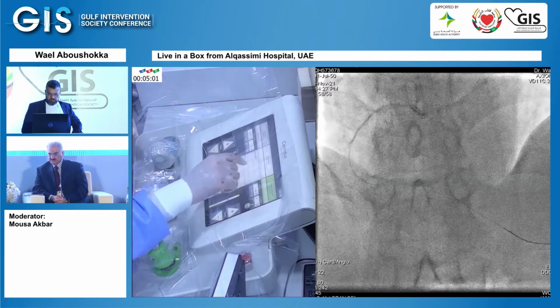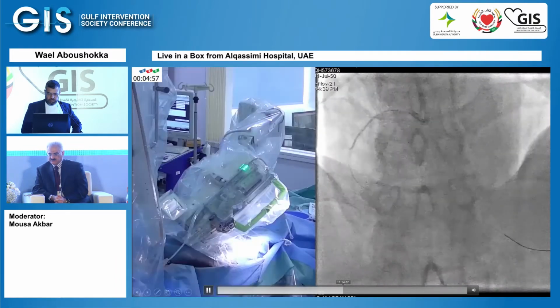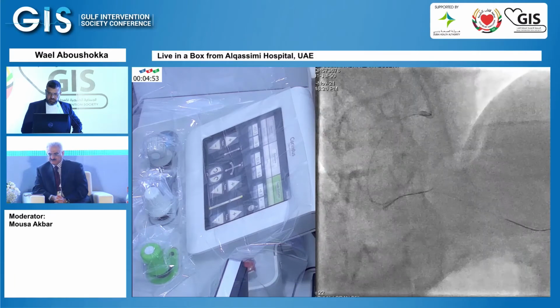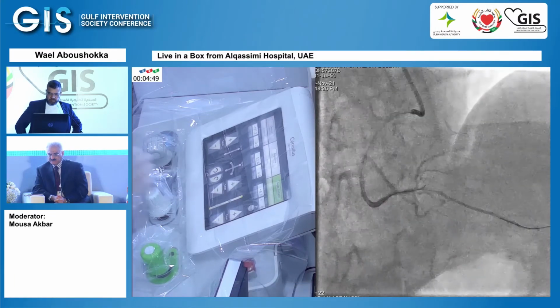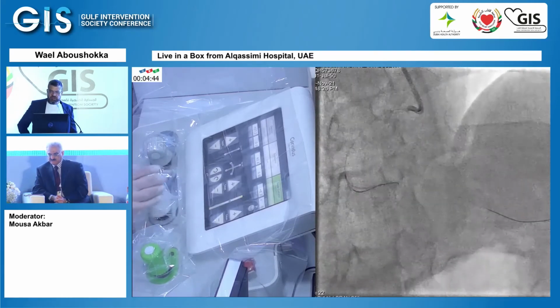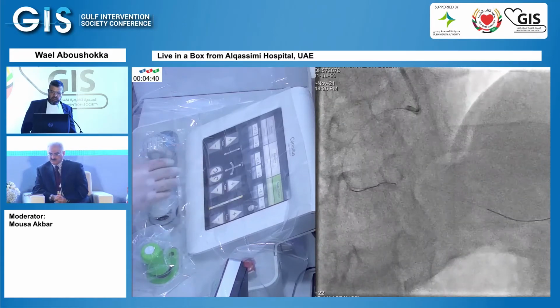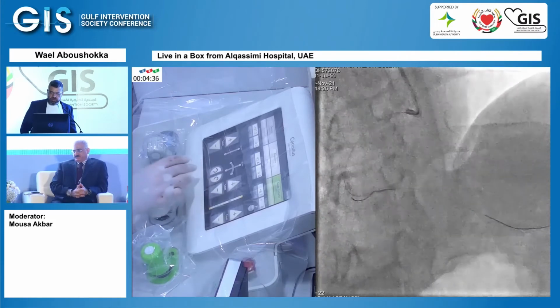Now we need to go to the wiggle curve. Small test, please. So there was a lot of branches going in, but we managed at the end to go to the PLA main branch.